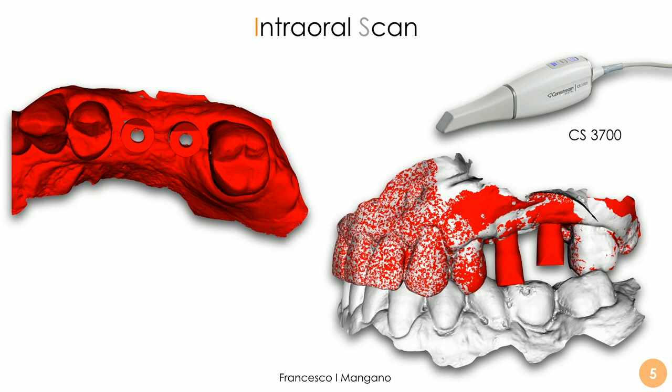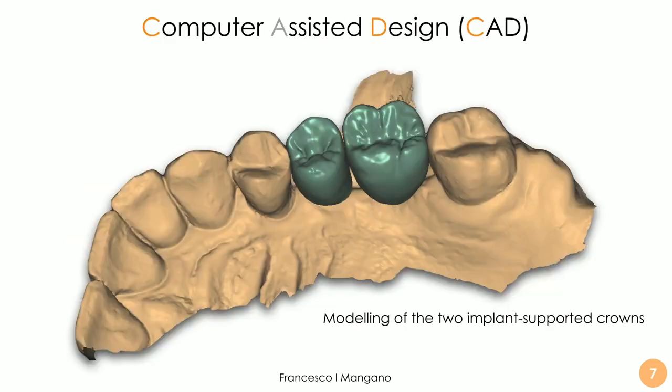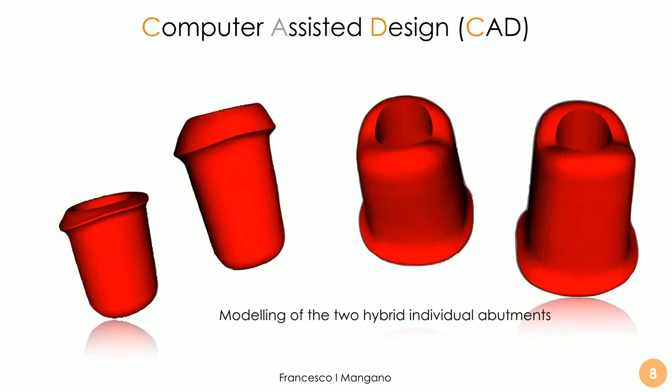The dental technician receives the scan — the master model with and without the mucosal collar, and with and without the scan bodies — and is then capable of modeling the restoration. In this case, two implant-supported crowns supported by individual hybrid abutments, also designed inside CAD software. These individual hybrid abutments are typically milled in zirconia and assembled by cementing them extraorally on a titanium base. With the DFAB by DWS system — a very powerful compact desktop machine, incredibly fast — we can print hybrid ceramic in a very short time frame with very good results.